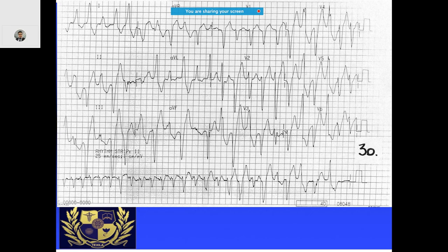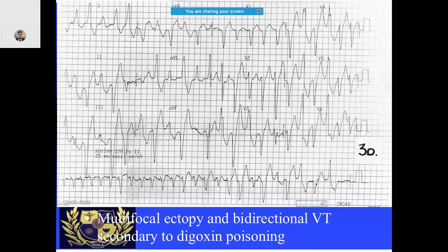In this ECG as well, looking at the rhythm strip, the same thing is happening — the axis keeps changing with alternate beats. The ectopy is different, and when reviewing the history, the patient was taking digoxin.